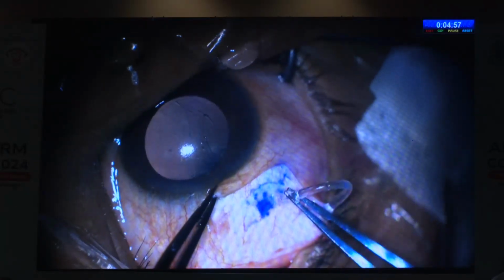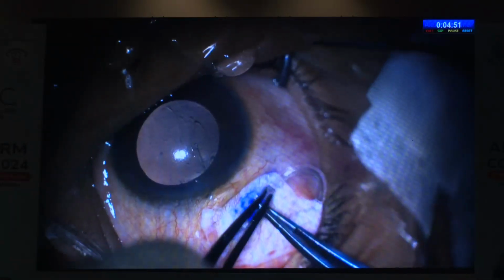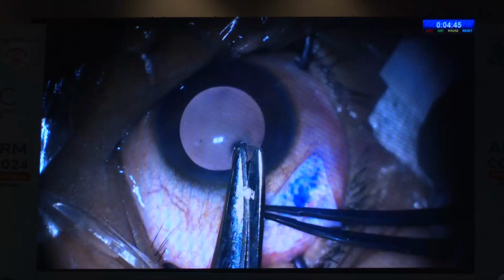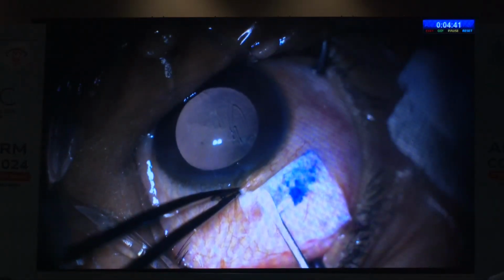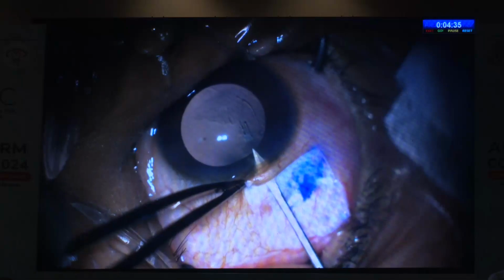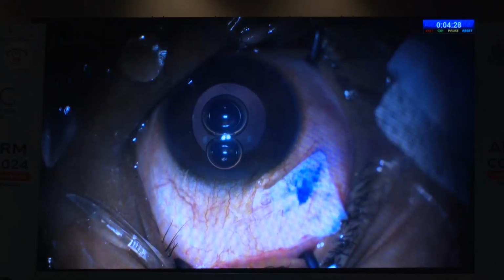The proximal end of Omniflow was now inserted and passed through the scleral tunnel after a few attempts. Then the proximal end was sharpened by cutting it obliquely using scissors. Now, a second scleral tunnel was made, radial to the limbus, 2 to 2.5 mm behind the limbus, which was then gently entered into the anterior chamber, bisecting the angle between the anterior chamber and the iris.